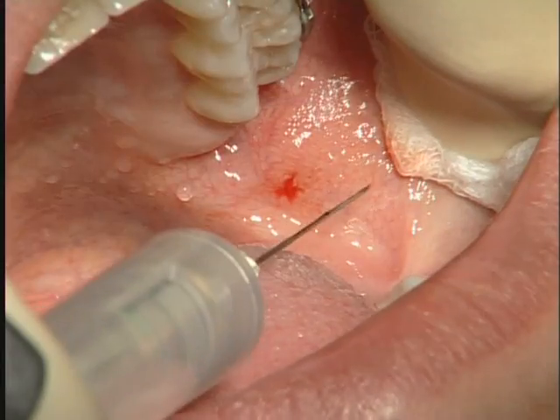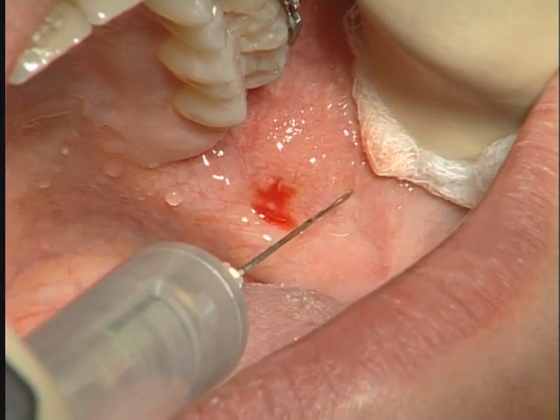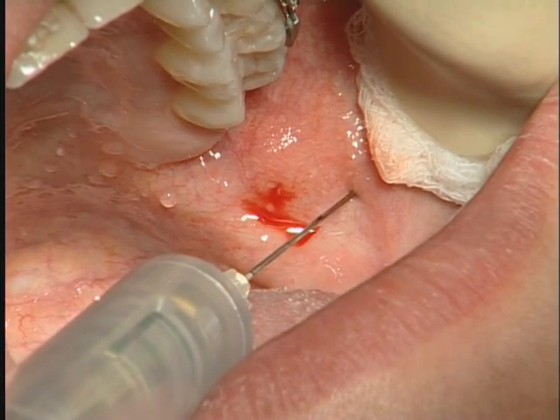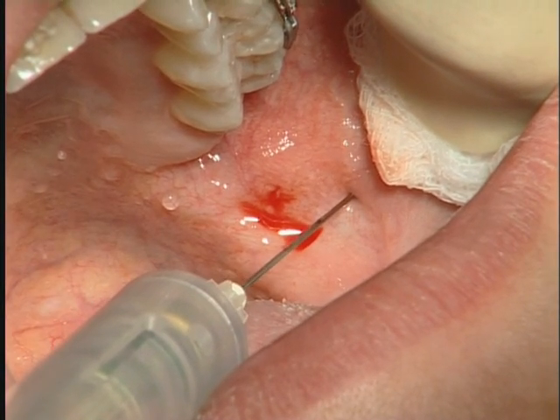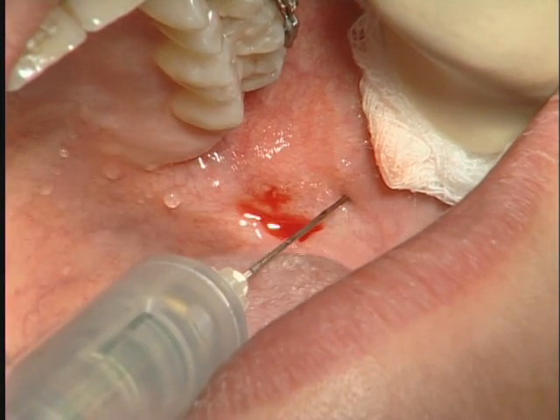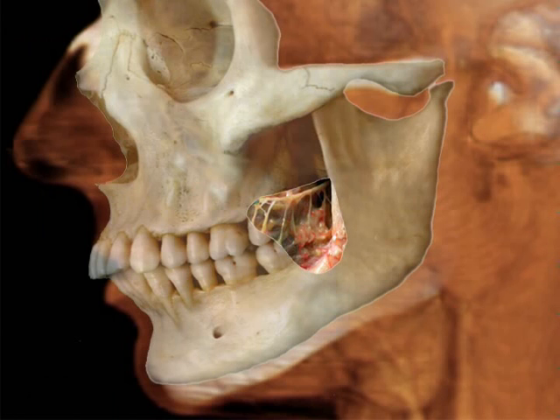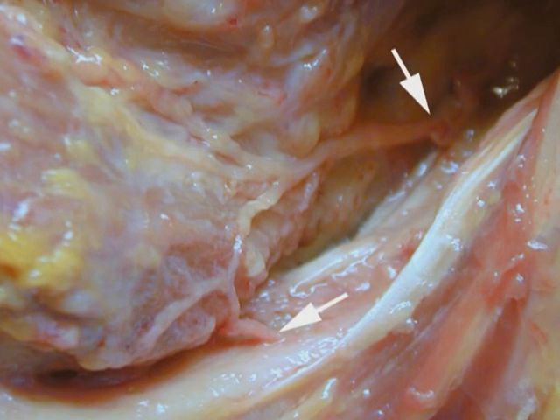Straight afterwards, anesthetize the buccal nerve by using another syringe with a shorter needle. By withdrawing your thumb slightly, you will find the anterior edge. Inject 0.5 milliliters of the solution just here. This extra injection will significantly improve the effectiveness of an inferior alveolar block, as the buccal nerve may well be involved in the innervation of the lower molars.